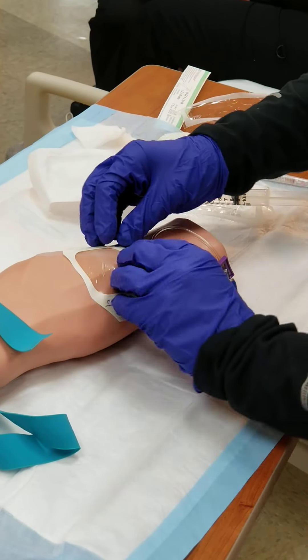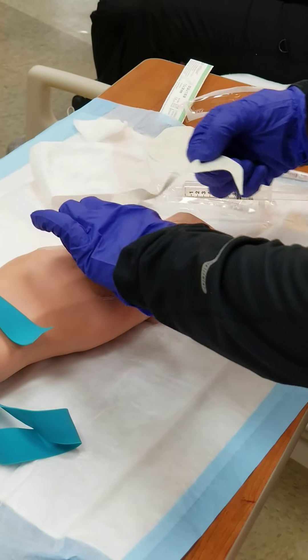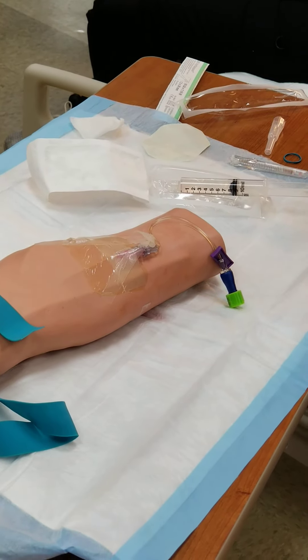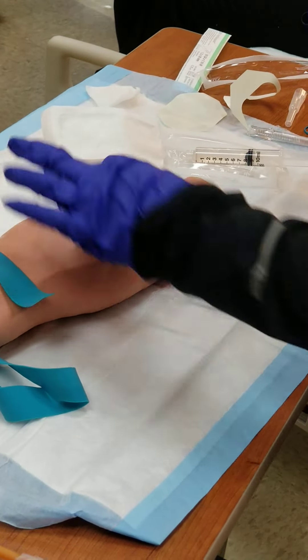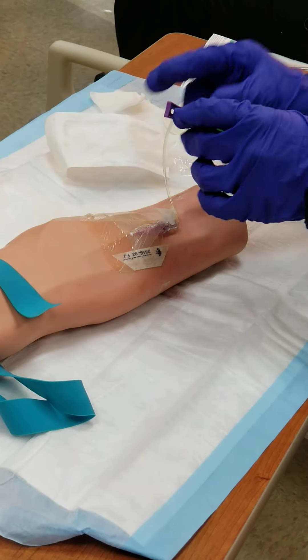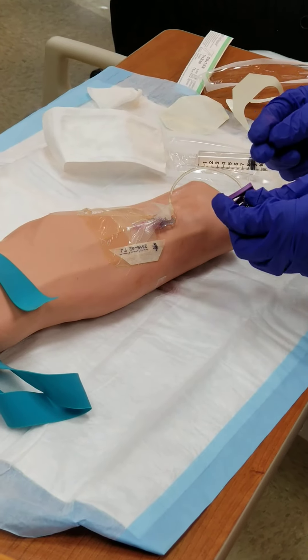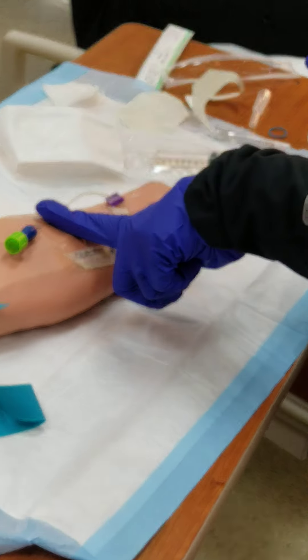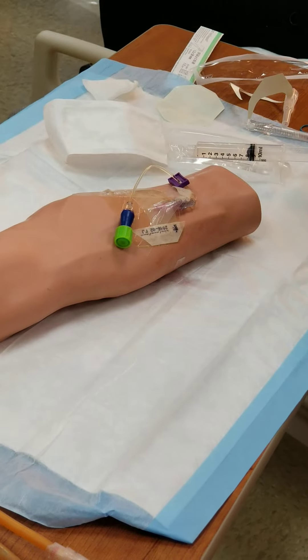What do I write on here? Time, date, and initials. And gauge — you want to know what gauge is in there. And then you go and you chart it. Off to the side, not on top — we want to make sure we can see that site. You do not have to close this off here; if you forget that's okay, the blood will not start coming out. And then you tape it around right there to get it up out of the way.